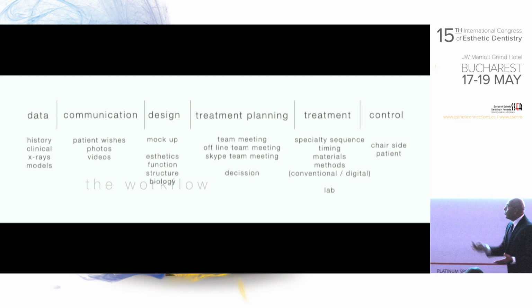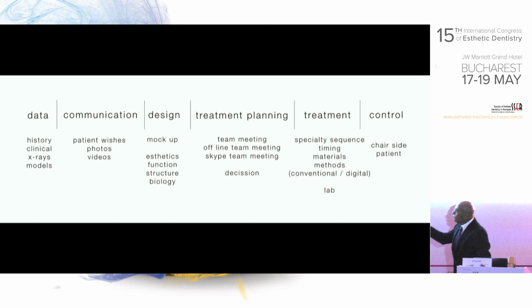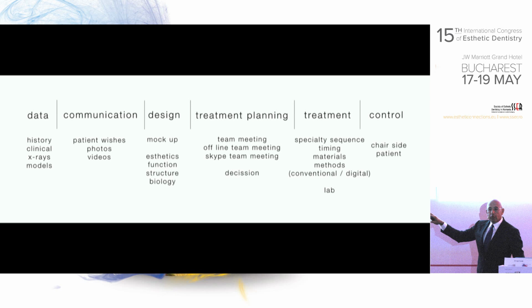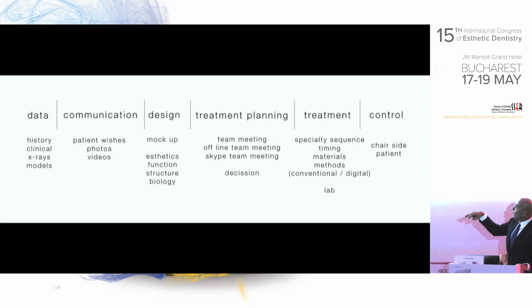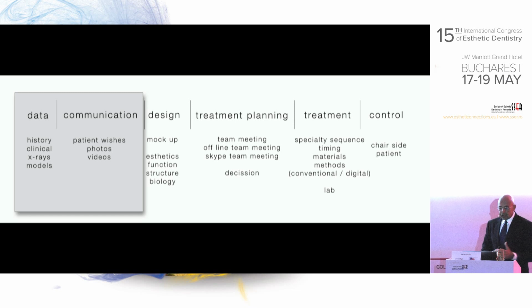In the workflow, we all know that this is our basic workflow. Whatever case we work with, we apply these steps. When we divide them into groups, in the beginning, when the patient walks in, this is the data collection and communication.